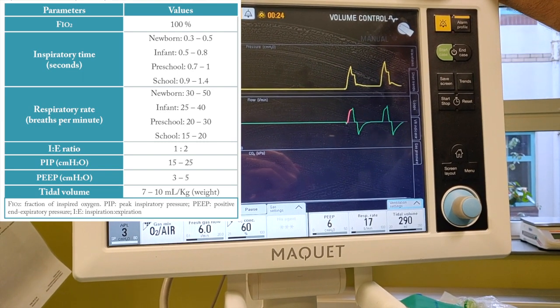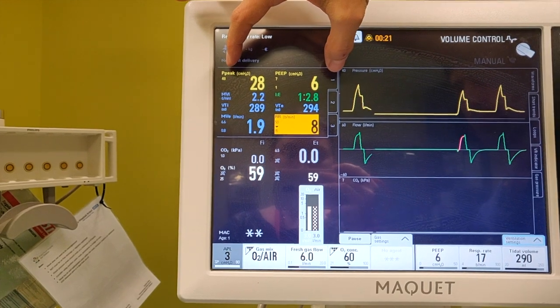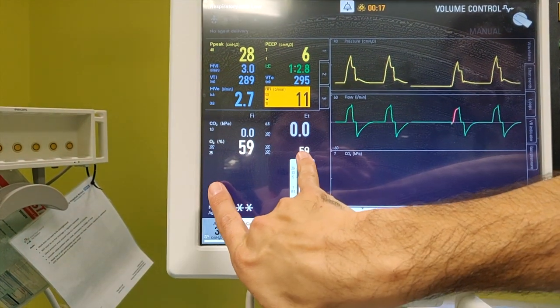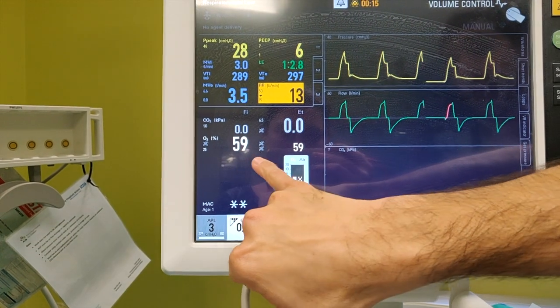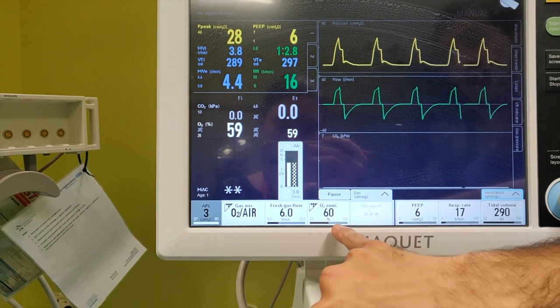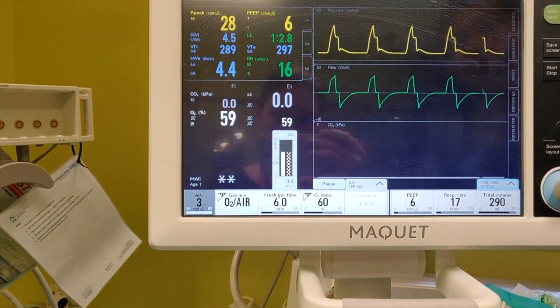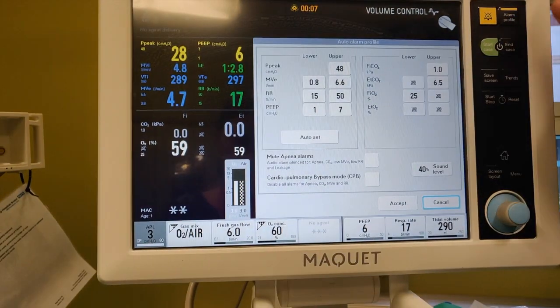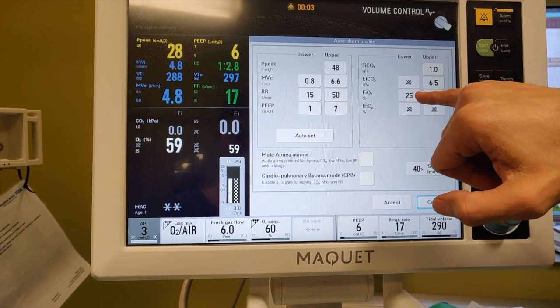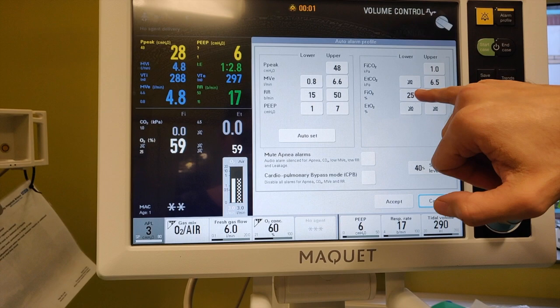Other bits and pieces on here — you've got your standard pressures coming up at the top. Down the bottom you've got your gases. You've got a different gas display than we've got on the unit. We've got our inspired FiO2, so it should hopefully be very similar. You will have to set these up again by coming into the alarm profiles — your FiO2 is down here. So if you're getting a FiO2 low alarm because you're in room air, you just need to change it.